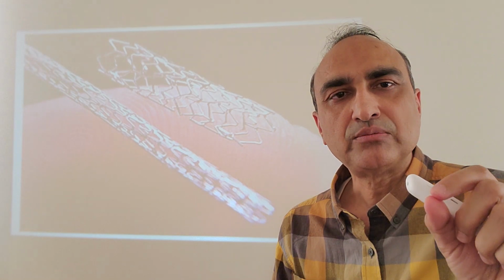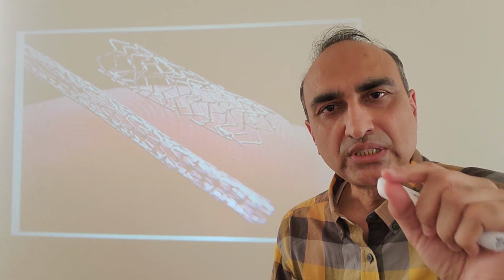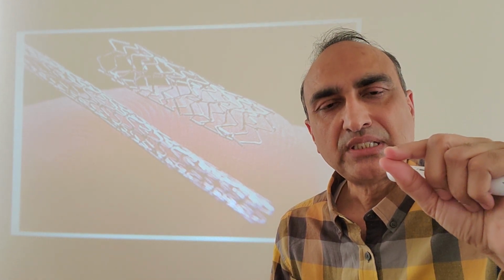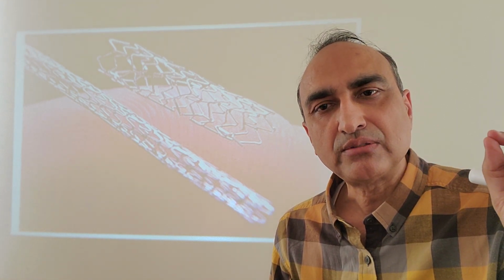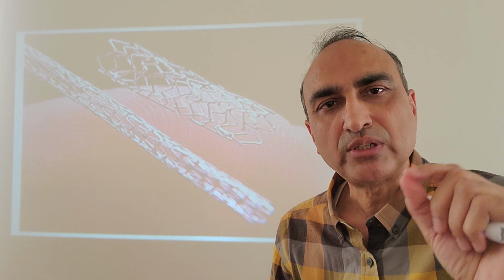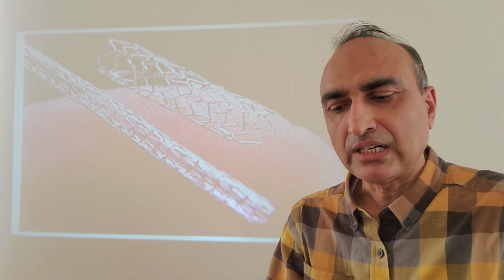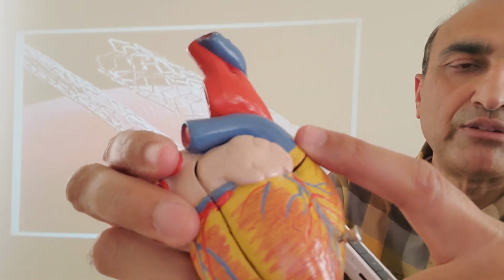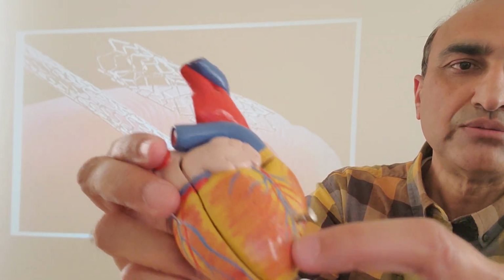The nice design of the stent is that it is mounted on a balloon, and that balloon is all squeezed with machines. Then with a very fine 0.014 inch wire, we take it all the way up to the arteries. We go inside the artery, we leave our guide catheter here, and the wire goes through the vessel.